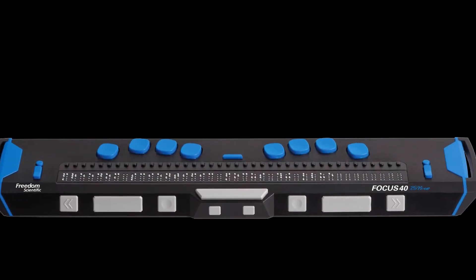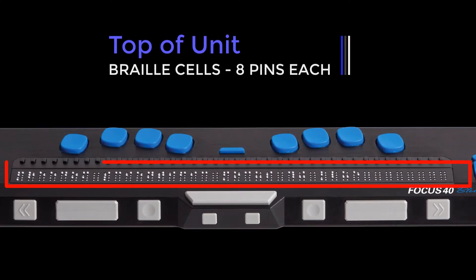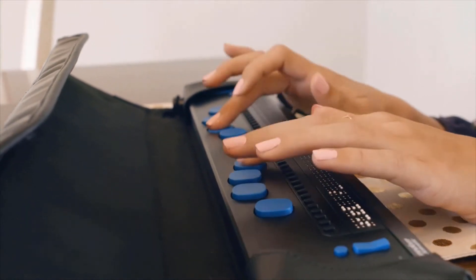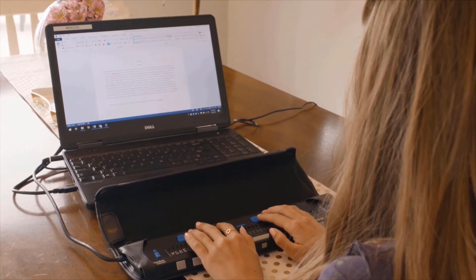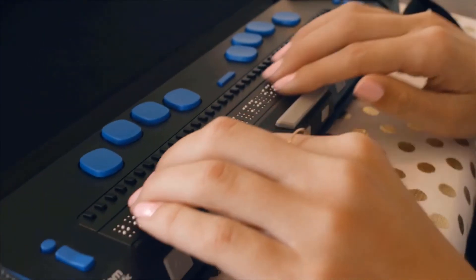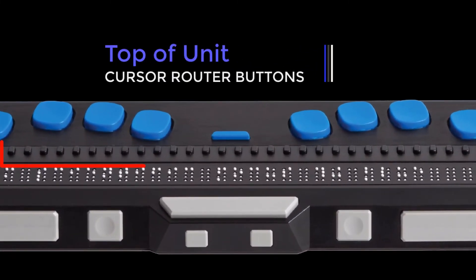The refreshable braille cells are near the front of the unit. A refreshable display creates braille by electronically raising and lowering different combinations of pins within each braille cell. Cursor router buttons, which are found directly above each braille cell, can be used to move directly to that point or to select a link.